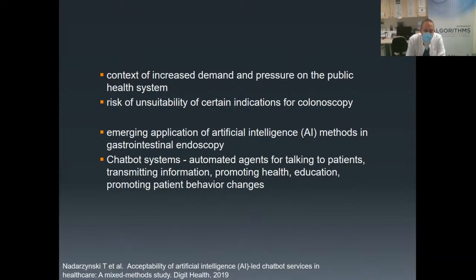In this context, there is also increased demand and pressure on the public health system. And also, we need to consider increasing the risk of unsuitability of certain indications for this procedure. We observe in recent years the emergence of application of different artificial intelligence methods in gastrointestinal endoscopy.